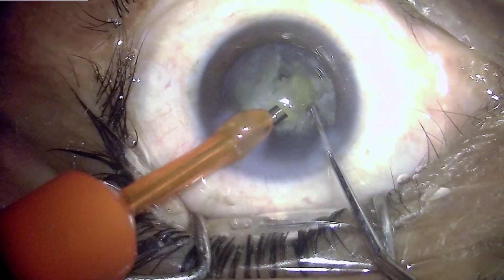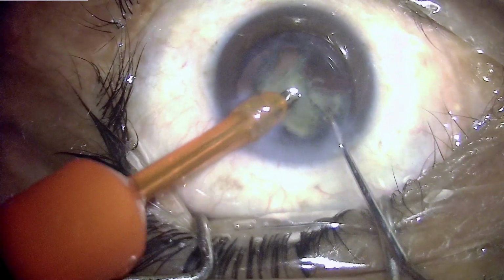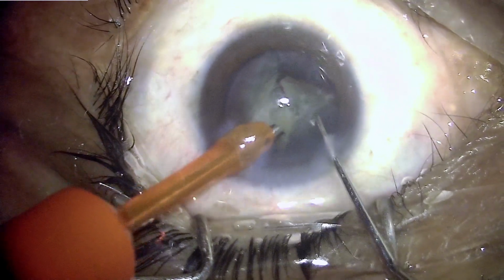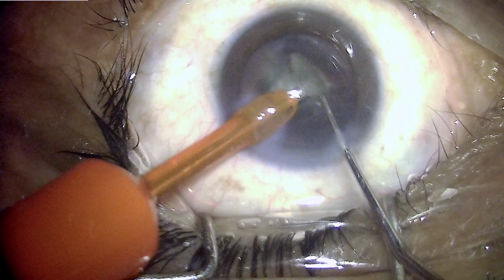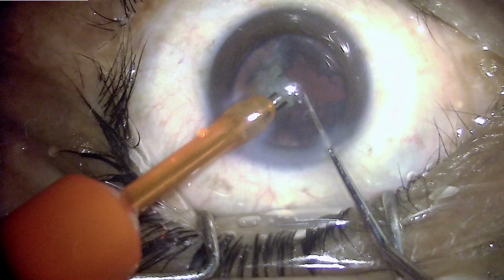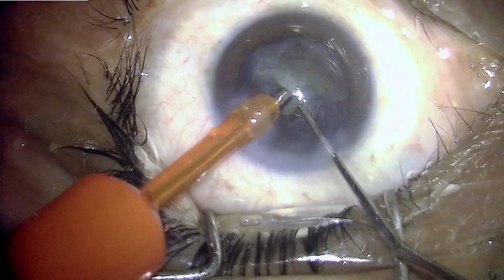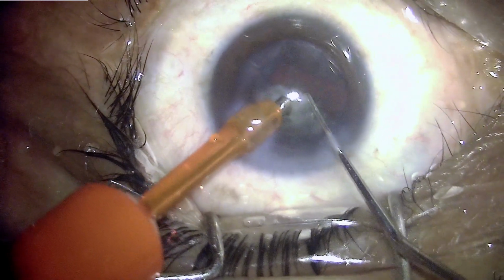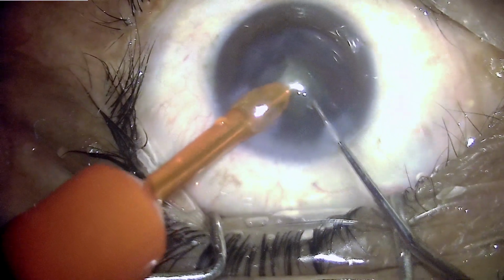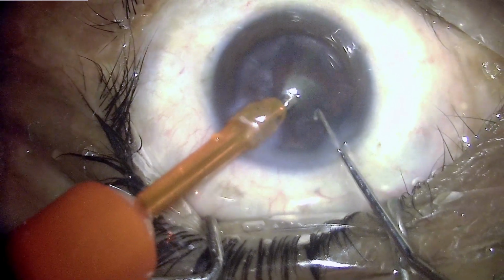However, we have chopped the half of the nucleus into smaller pieces, and we are proceeding to emulsify them and remove them from the cavity. I usually use my right hand if possible, but in given situations where it can benefit the patient, I can switch to my left hand, and I have to take some special extra care. I have found that it is possible to do it with the left hand, but at times it becomes a little more time consuming and I have to strain myself more than what I can do with my right hand.